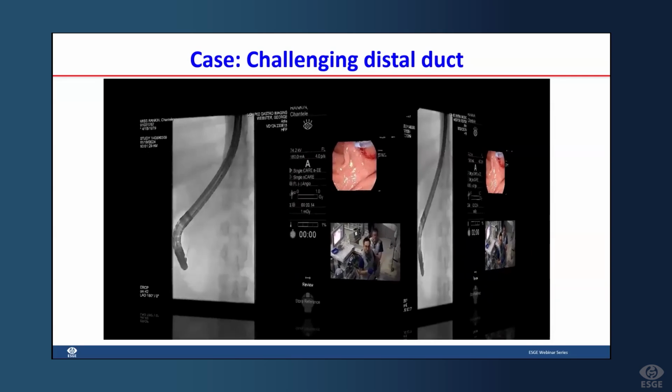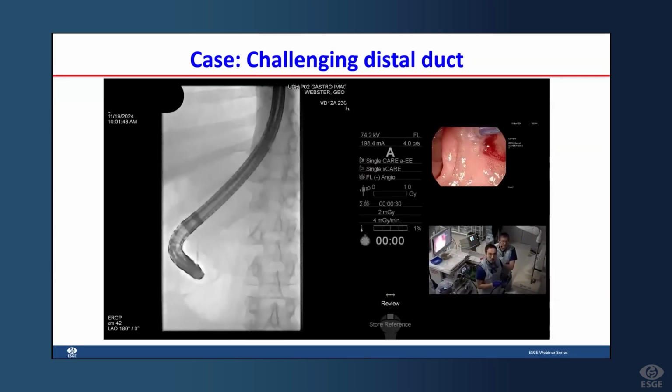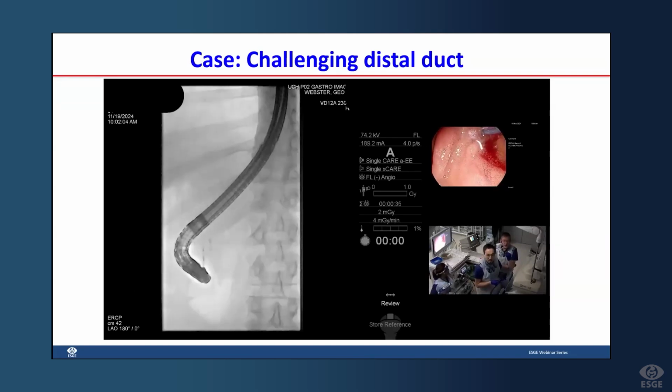Looks like a lovely line. I'm not sure you are, really. I don't think it's a crime to put a little sniff of contrast just to see where you are, as long as you do it under active screening. Screen, please. And just inject there, stop there.